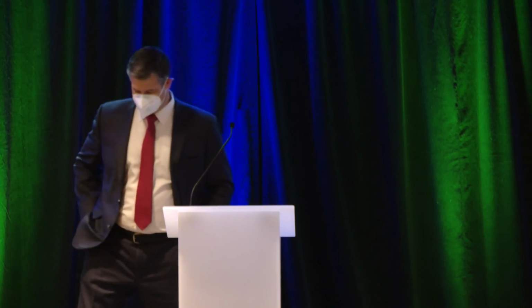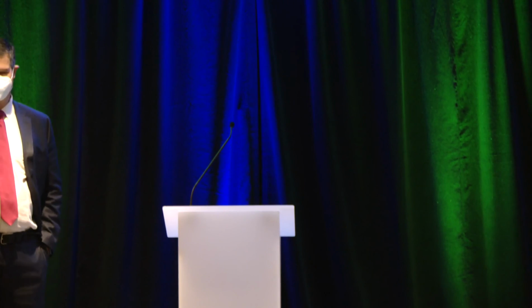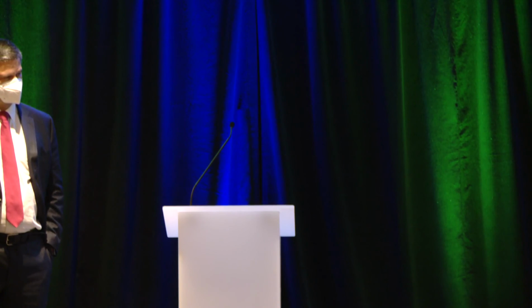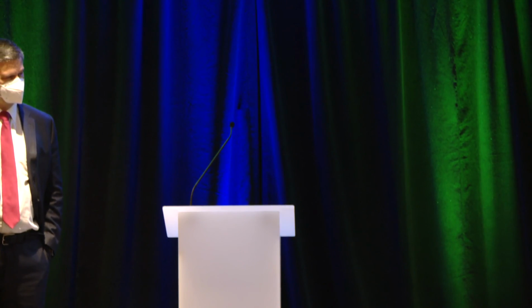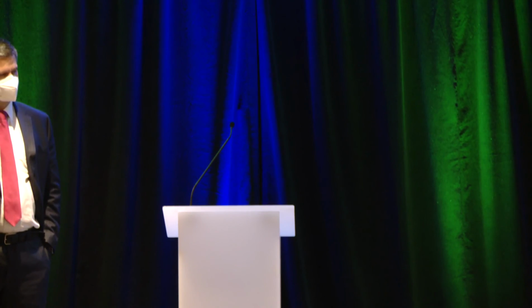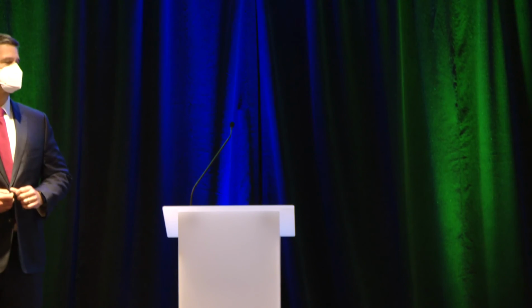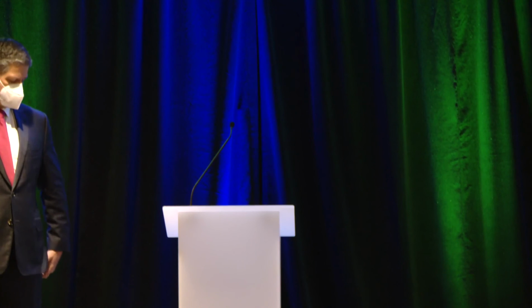I can say something about that. It's a tough question for a basics of manometry course, but for FLIP, and you'll probably hear a lot about this during the main session, a lot of the plans for FLIP down the road, with future directions, are to do indeed that for some clinical scenarios. I think what we know now is that the most powerful FLIP result is a normal result. So if you think about EGJ outflow obstruction and what FLIP tells you, if the patient has normal EGJ outflow on FLIP, it fits very well with Chicago 4.0.